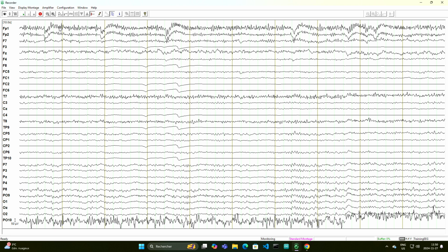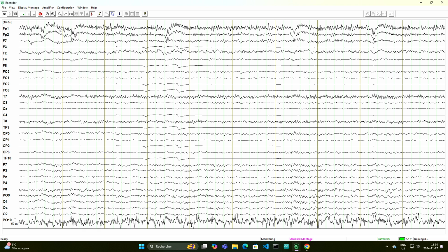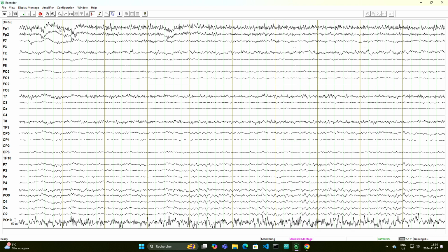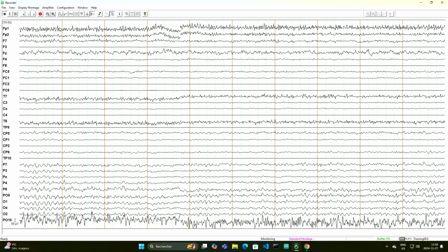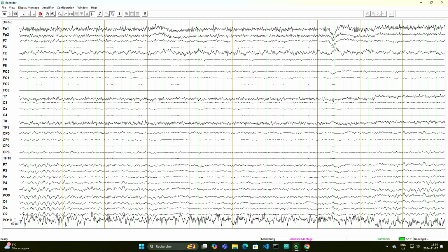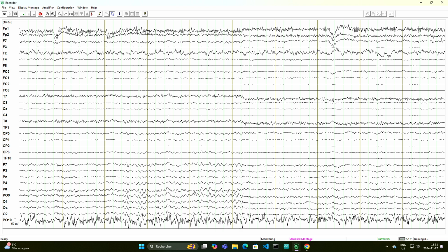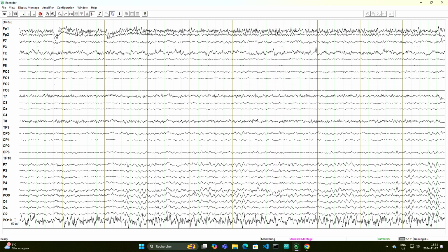And there's a known phenomenon that when we close our eyes, we will cause an increase in the amplitude of the alpha band. So I'm going to ask Anne to close her eyes in a relaxed way and keep them closed. Now open your eyes. And close your eyes. Keep them closed.